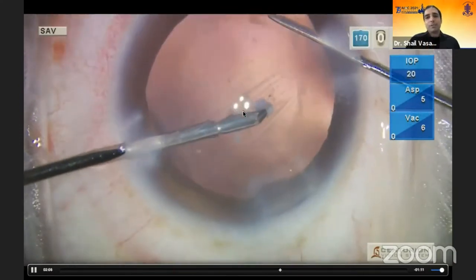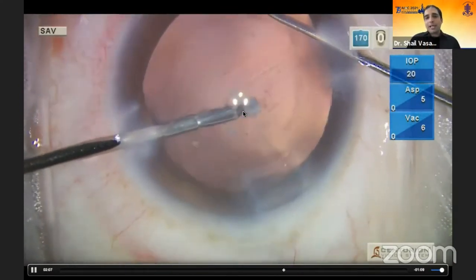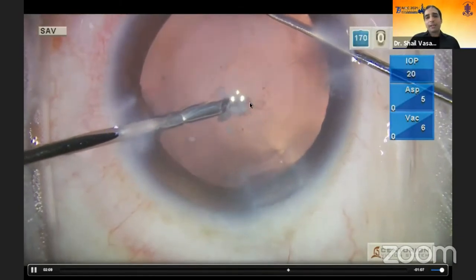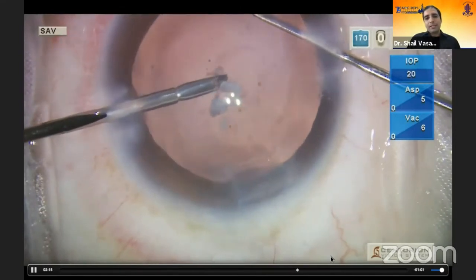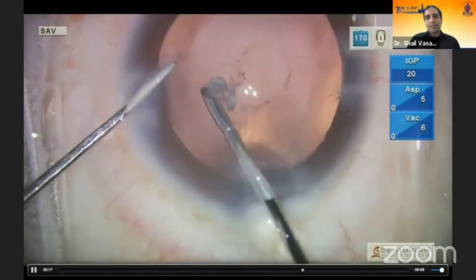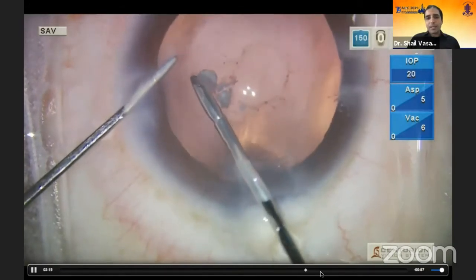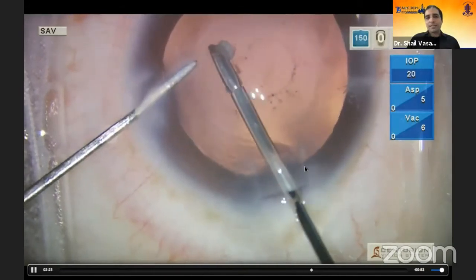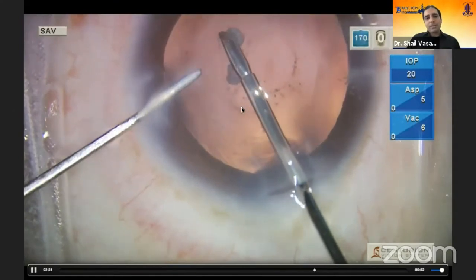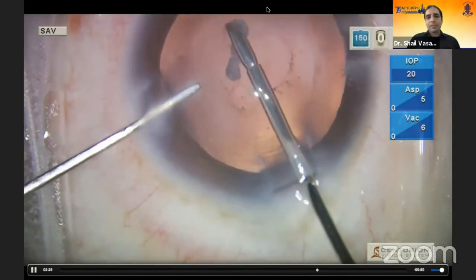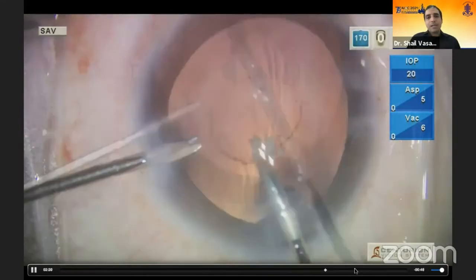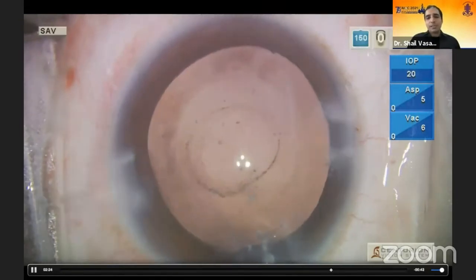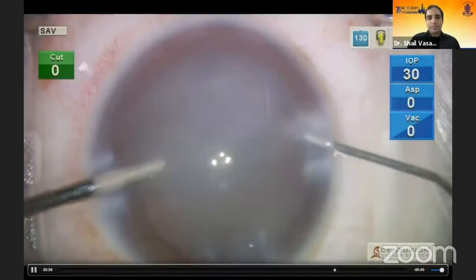The best way to stabilize the tear is to convert it into a posterior capsulorhexis, because if left as a small defect and you inject an IOL in the bag, it can easily split and result in an unstable single-piece IOL. We encompass the plaque area as well — converting the tear into a posterior capsulorhexis with a strong margin also gives the patient a clearer visual axis. Microincision holding rhexis forceps are needed for this step. Always verify there is no vitreous disturbance; preservative-free triamcinolone is the way to go.